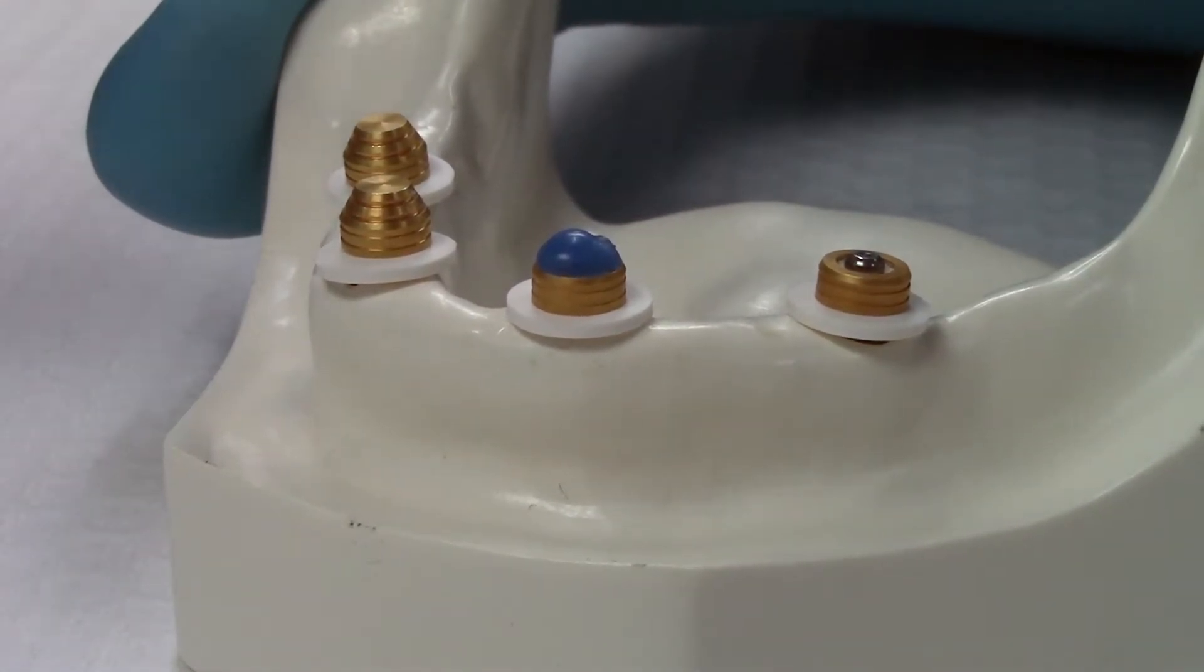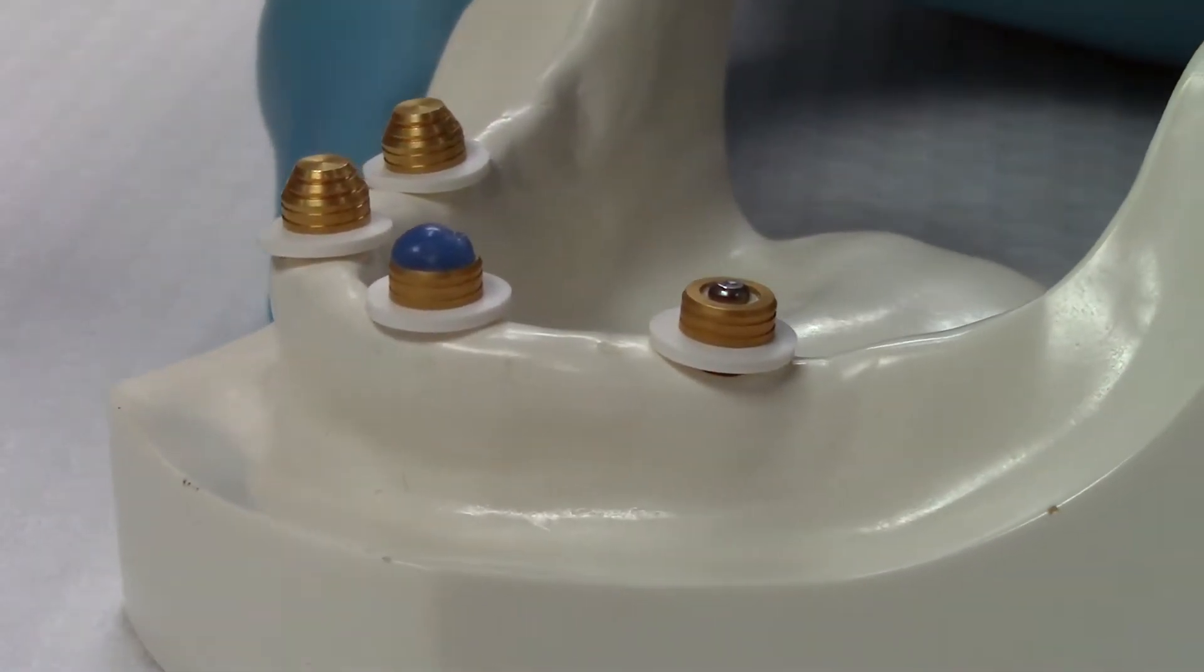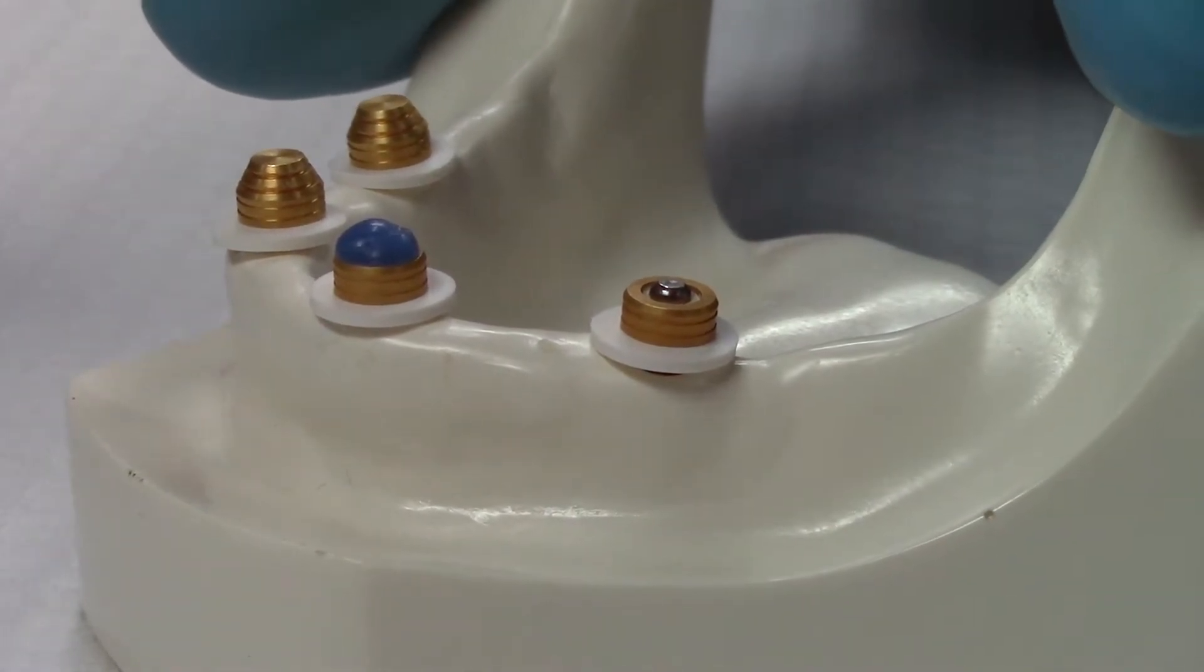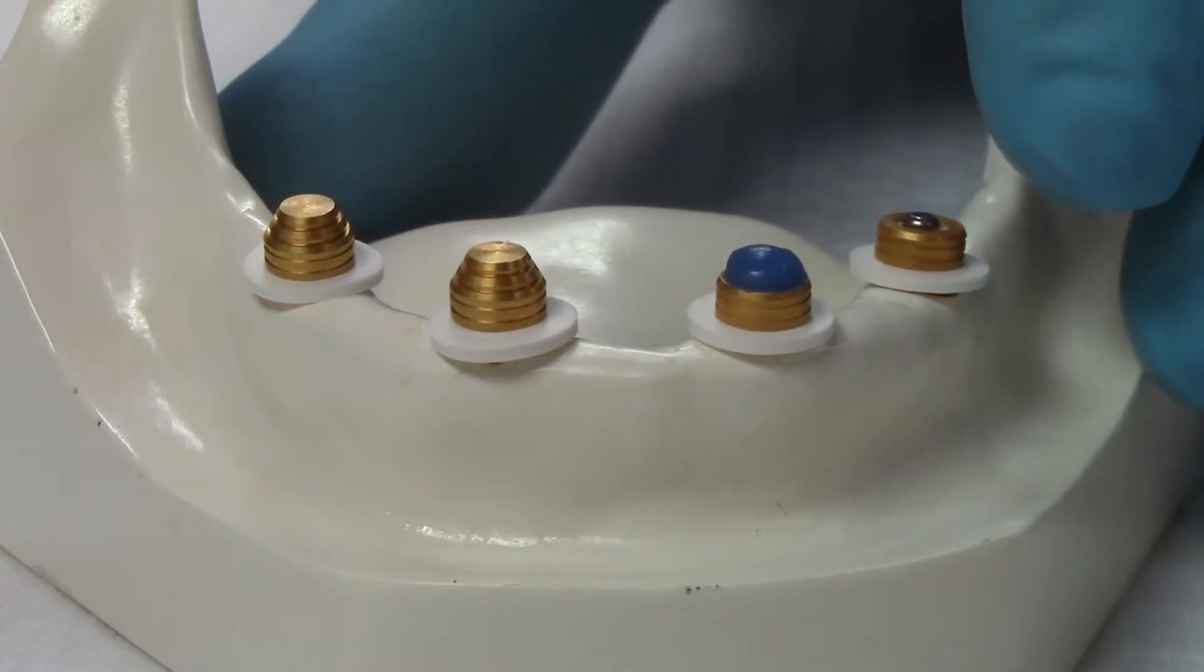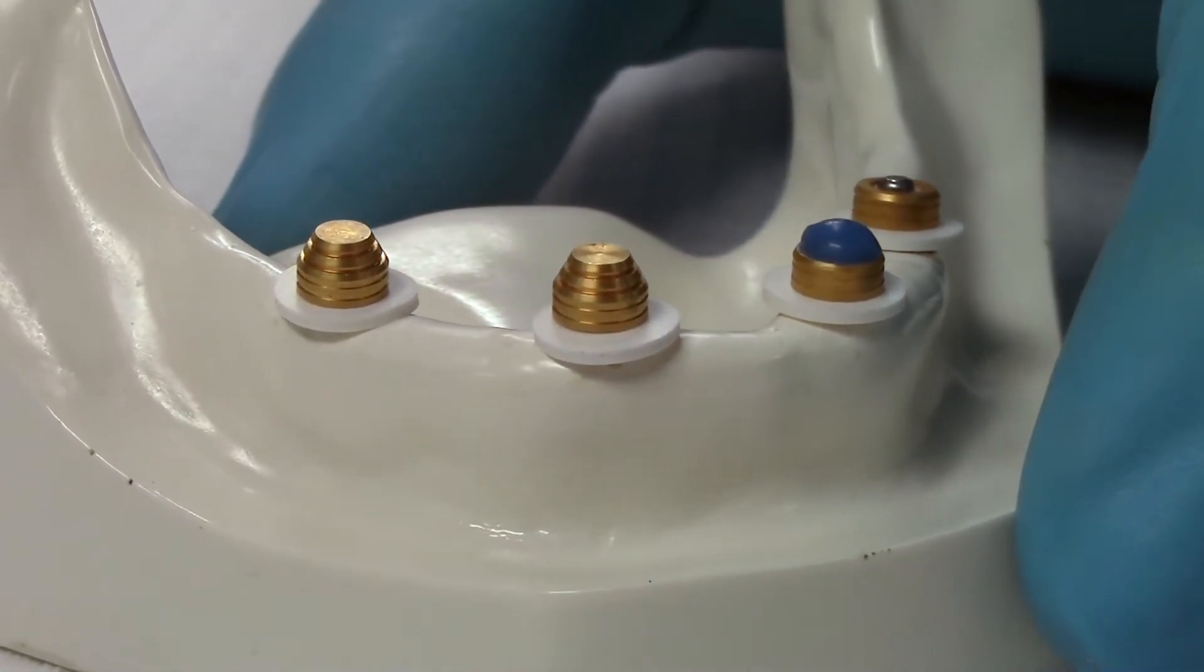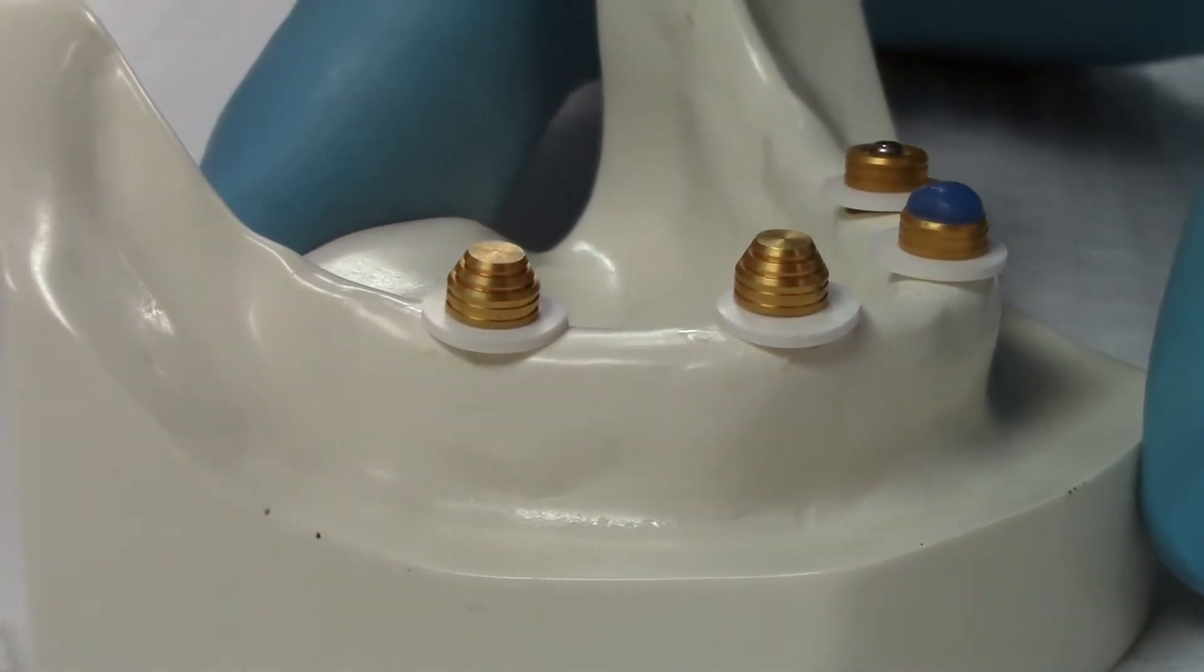Of course, you must block out the occlusal space above the retention ring to allow the ring to move vertically during function without contacting the acrylic of the denture. Otherwise, the acrylic will break.